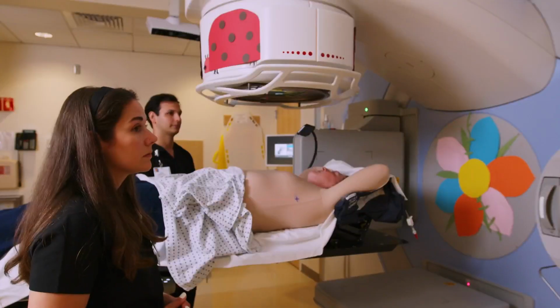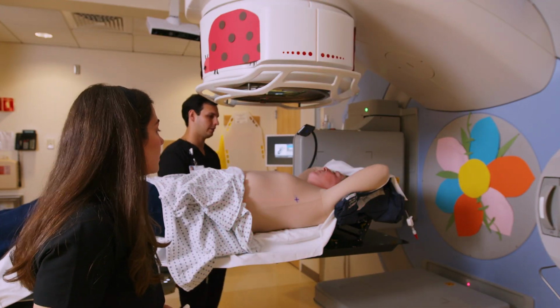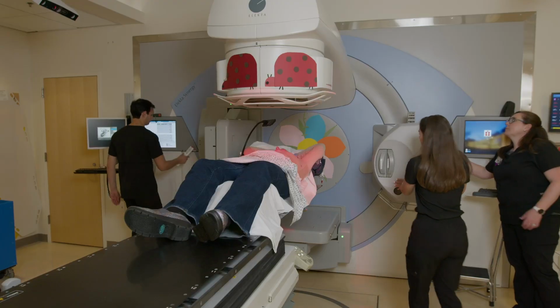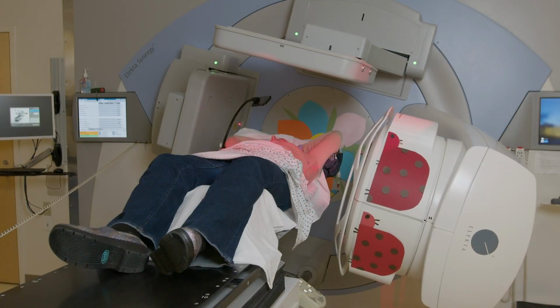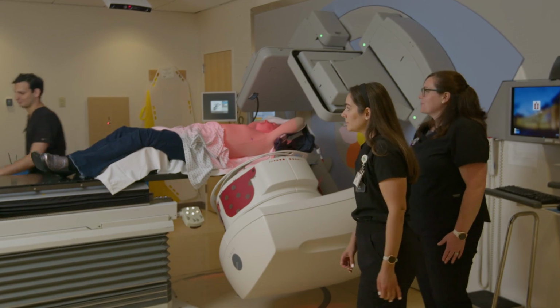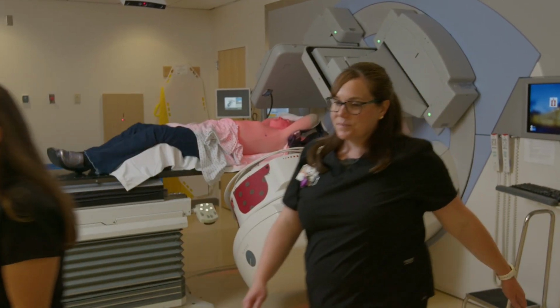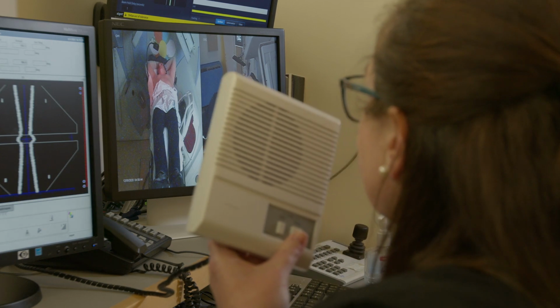Before stepping out of the room, the therapist will prepare to take setup images, which may be an X-ray or a low-dose scan. This is standard practice for your first appointment to verify your internal positioning is the same as your simulation day. Once the therapists are outside of the room, they'll make sure that you can hear them on the intercom. They'll ask you to take a deep breath in through your nose and hold.